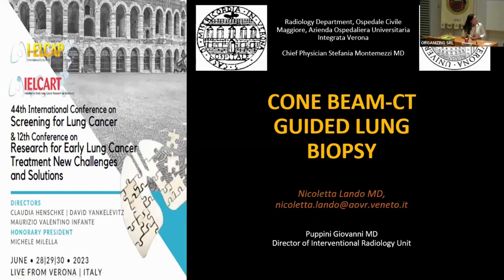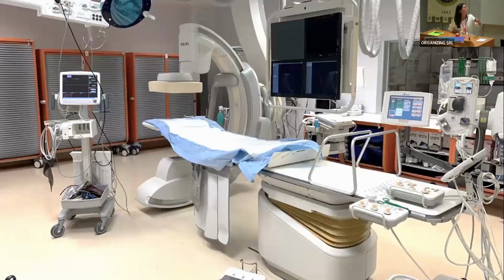So here we are. When I came to the preparation of these slides, I actually thought what various specialists would like to hear from me. So the first picture I show you is how an angio suite looks like in reality.